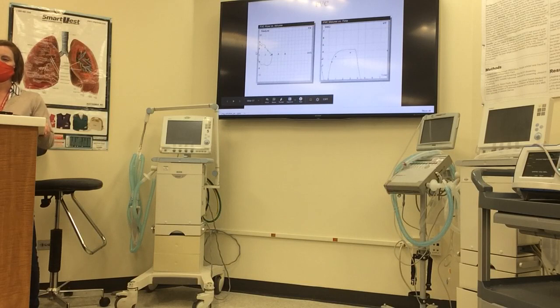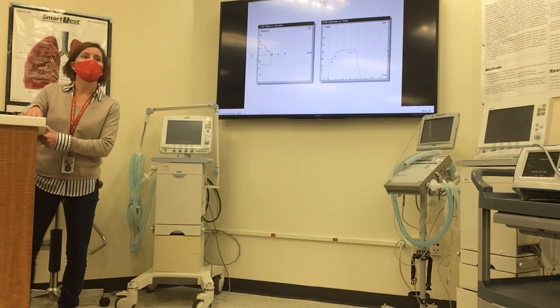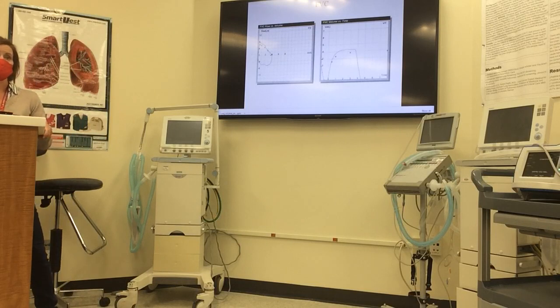Okay, and this is what we're going to look at. This would be our patient taking a breath in, and up here at the very top, they would blow out as hard as they can. Now they should be blowing all the way to 6 seconds here, but they only blew to about 4.5 seconds, which is okay. And then this is the inspiratory portion. And this flow volume loop is what we're going to work on and measure via spirometry.